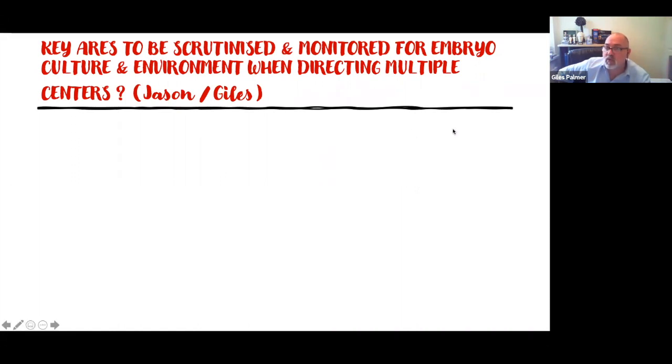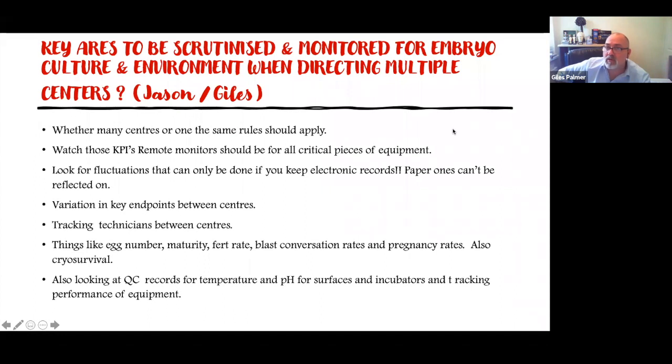And there are various ways. There's a big focus going on with cryo storage now, not just with remote monitoring, but also visual aids. So you can see, like with a thermo-sensitive camera, if those dewars are failing, and it's time, beforehand, that you have to intervene. So again, technology is on our side to remotely look at these labs. It depends on going back on that data and reflecting on it.